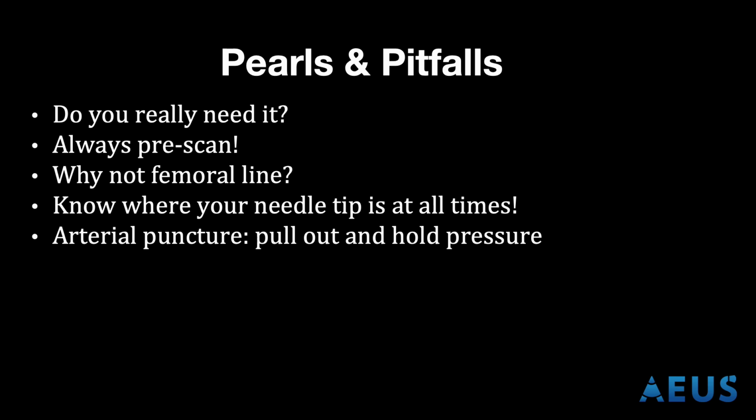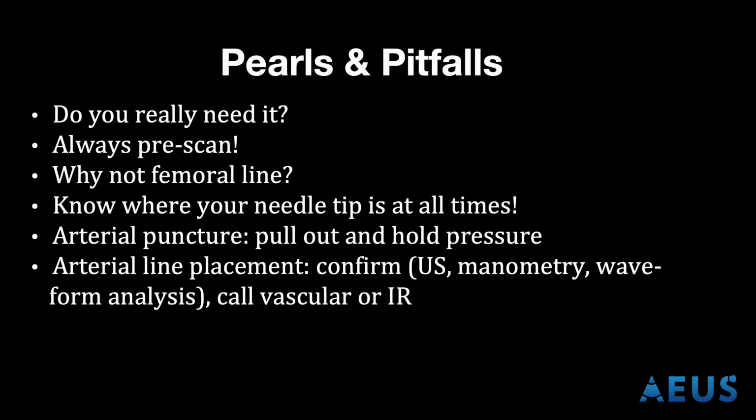What happens if you puncture your artery? If you puncture an artery, such as the carotid, before you have dilated or placed any other materials, simply pull out and hold pressure. At that point in time, depending on the amount of extravasation that's caused, you should consider using an alternative site for future central venous catheter placement.